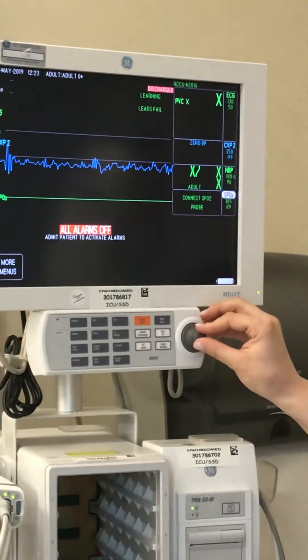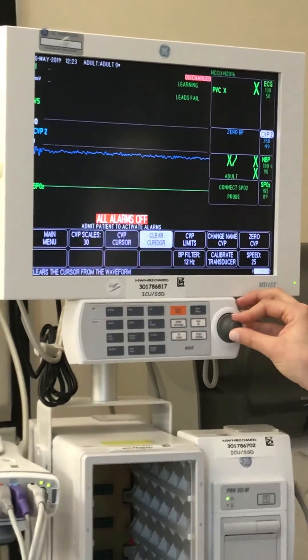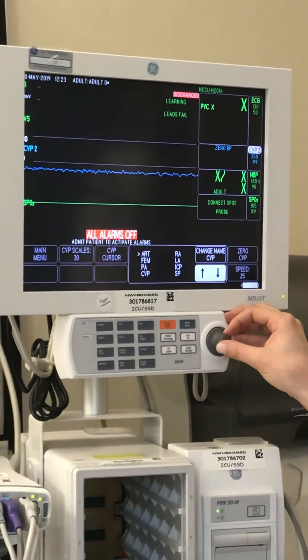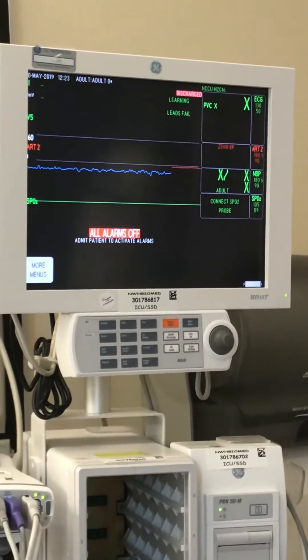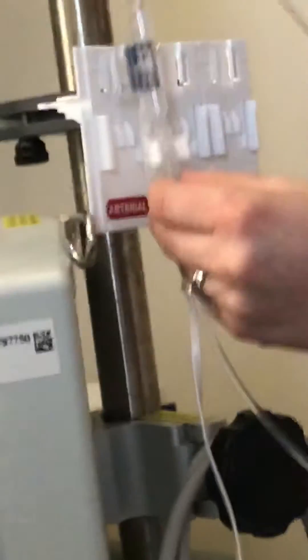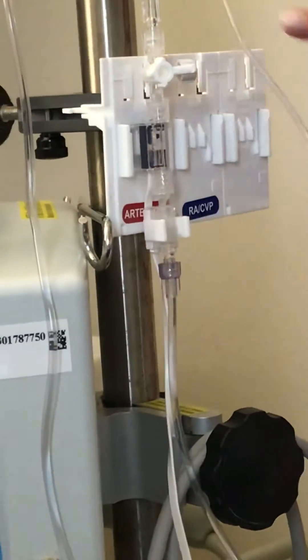You can change the monitor setting by scrolling over and clicking on it — whether it's CVP or A-line — then scrolling over to change the name. This allows you to change it from arterial to central venous to femoral to intracranial pressure monitoring. Once you choose your setting, confirm the transducer is right-side up: patient tubing should be on top, tubing to the bag on the bottom where the squeeze is located, and the leveling port is up top.